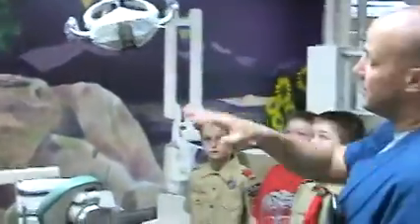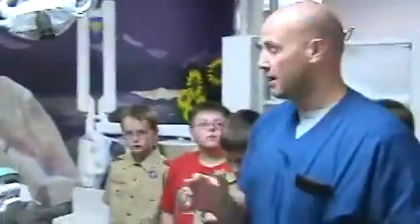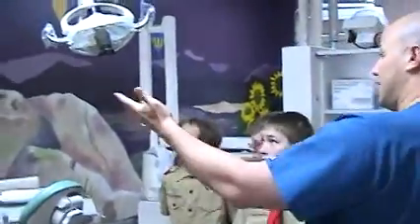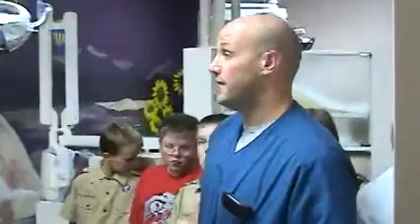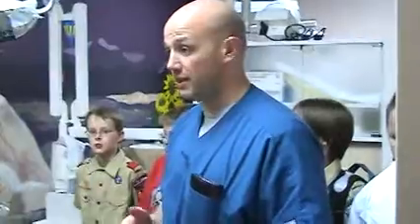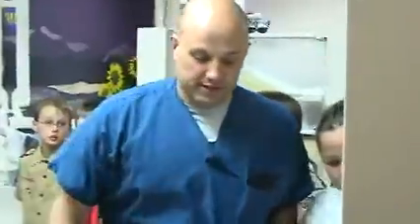Wow, these are cool offices, huh? Yeah, so people can actually see a picture when they have their teeth drilled. A lot has changed in dentistry. We have digital radiography now, so when we take radiographs, the assistants can pull it up there and we can show the patient this is exactly what you have. We can take intraoral photos and say, okay, this is why you need what you need. So it helps us out a lot as far as patient education, showing the patients why they have different dental needs.